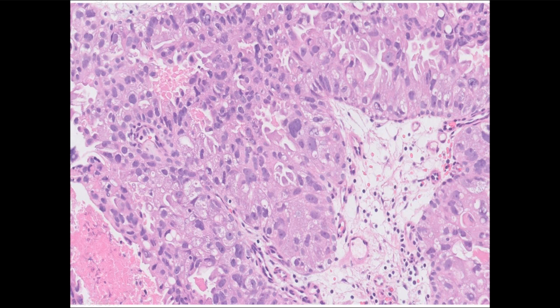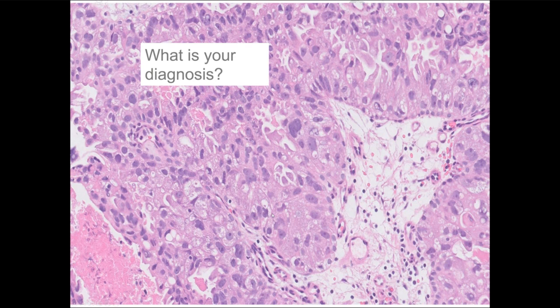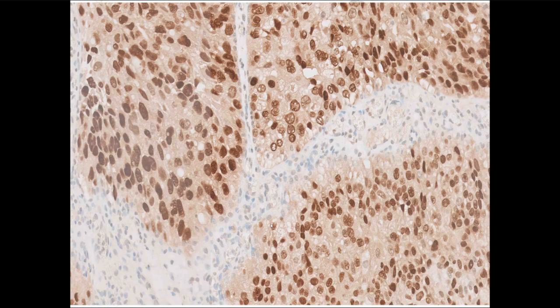So I have been burned a few times because of buying into the morphological appearance of the tumor and not questioning the diagnosis of prostate cancer, either extending into the bladder or metastatic. So if we were doing a poll, I'm going to ask you, what's your diagnosis?